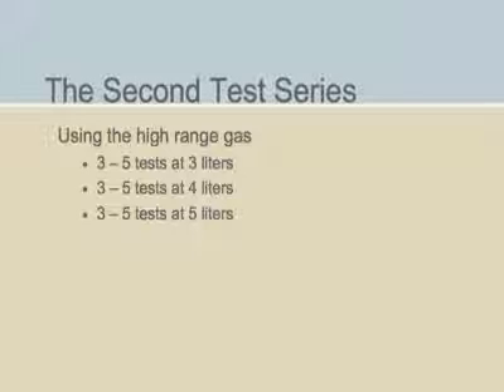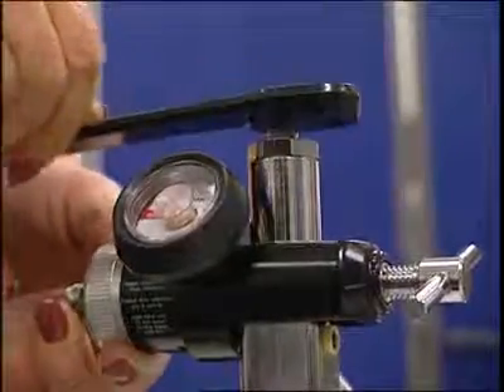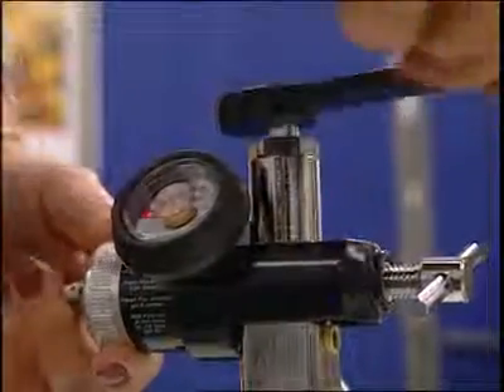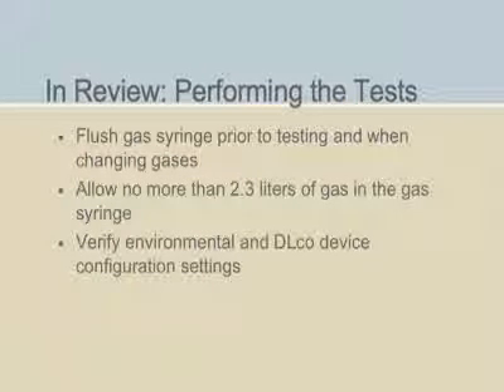If you will be testing a third simulator test gas, repeat the process as defined for the second series of tests. Then turn off the gas, as the final stage of the DLCO simulation testing is done. You've prepared the simulator for testing, done a trial run of the testing, and finally, the testing itself.